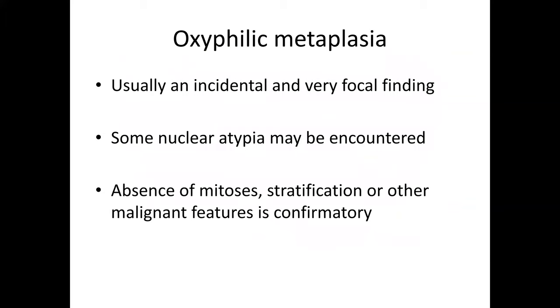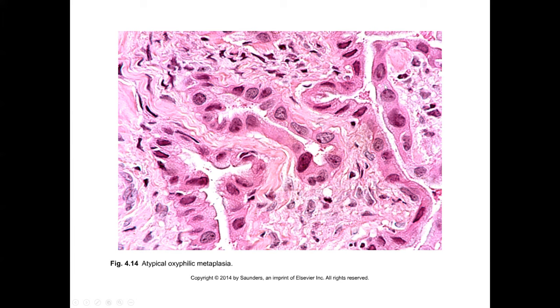Another benign entity is oxyphilic metaplasia. This is usually very focal and often won't merit mention, but can be of concern because sometimes there's nuclear atypia. Not seeing mitoses, stratification, or other malignant features can reassure one. At high magnification, cells with a little pleomorphism and very eosinophilic cytoplasm look quite different from normal endocervical cells. Wondering about clear cell carcinoma with eosinophilic cytoplasm or some variant of adenocarcinoma is understandable, but you would not see invasive, confluent growth or other features of malignancy.